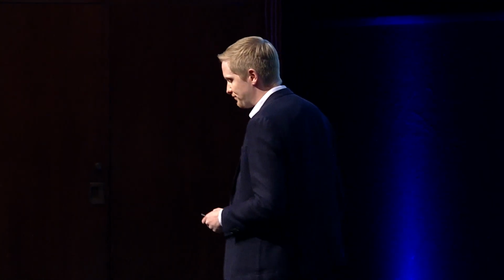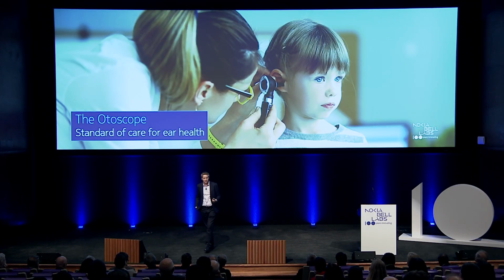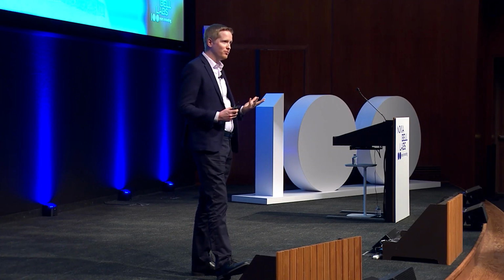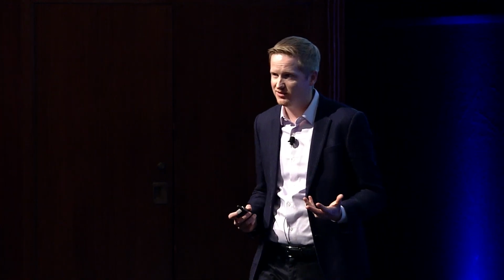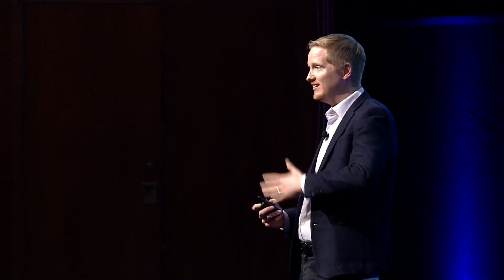One of these, which I want to talk about today, is our ear care, ear health, or hearing care. For the parents in the audience, this might be a very familiar picture. If your child is irritable, they say their ear hurts, maybe they can't hear well, you take them to the doctor, and this is what they do. They stick an otoscope in their ear and take a look. An otoscope, though, is a flashlight with a lens. All they can see is the eardrum. But the disease isn't on the eardrum, it's behind it. So how can you diagnose something, how can you treat something effectively, if you can't even see it? Unfortunately, the answer is you can't.